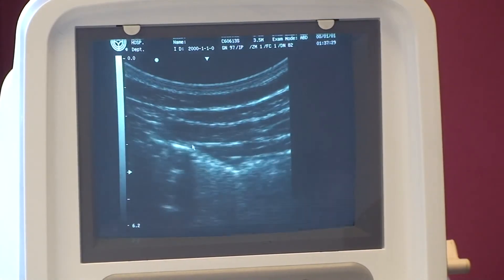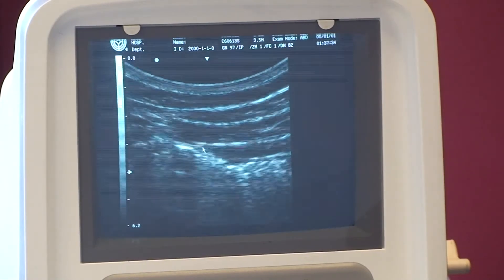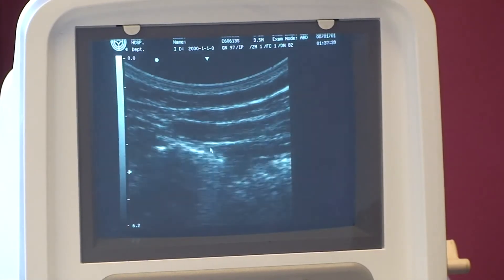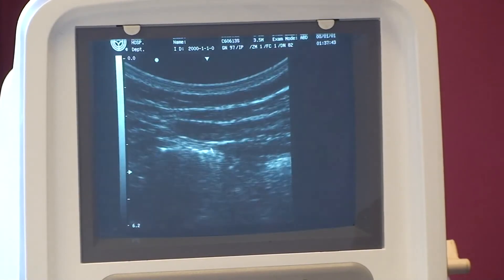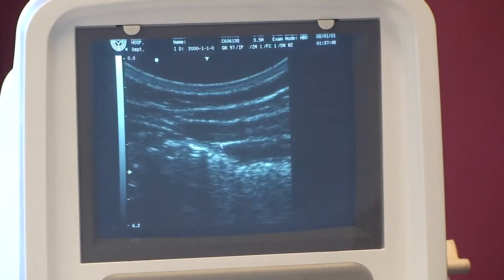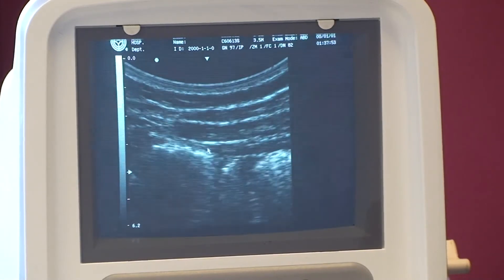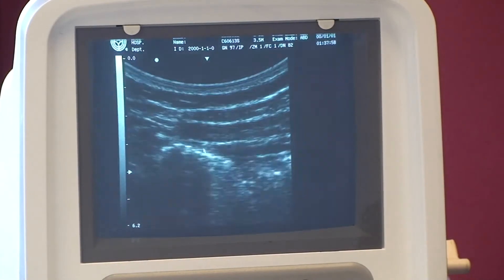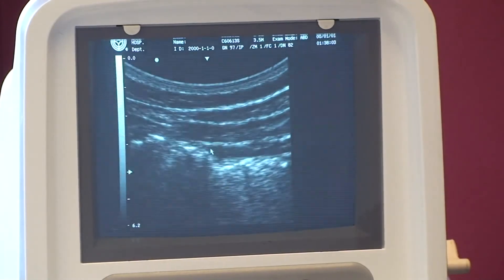Breathing in, breathing out — and a very slow, small slide. A little bit more. Now what you want to see is can they still breathe while they've got that contraction, which Alex is doing well. You'll often see fatigue and the contraction will let go. So you'd start with one contraction, build it up to five contractions. Your goal is to attempt ten contractions holding for a count of ten to retrain this muscle — but this can take weeks or sometimes even longer.